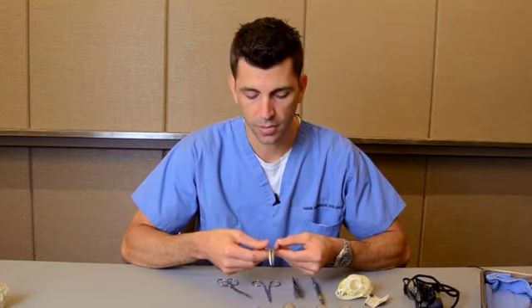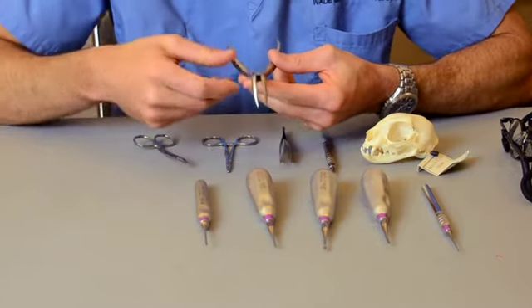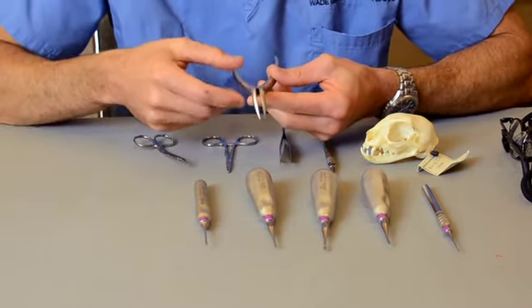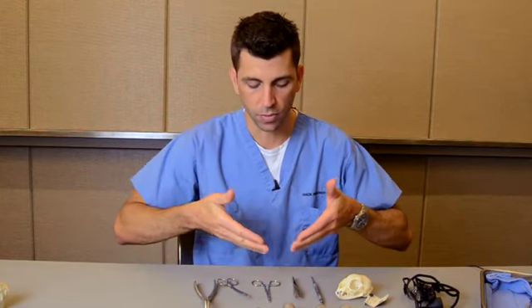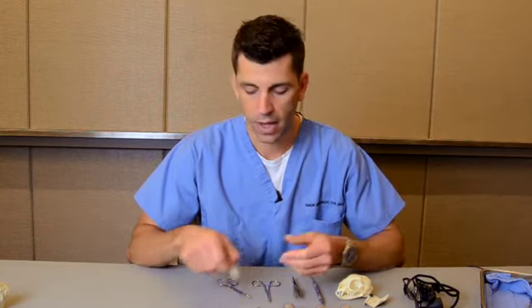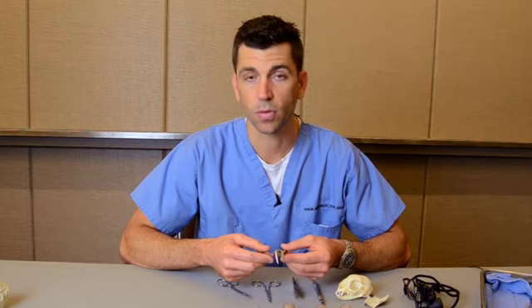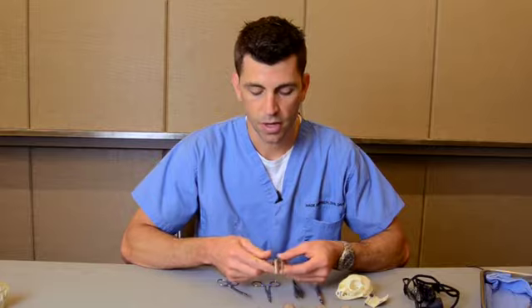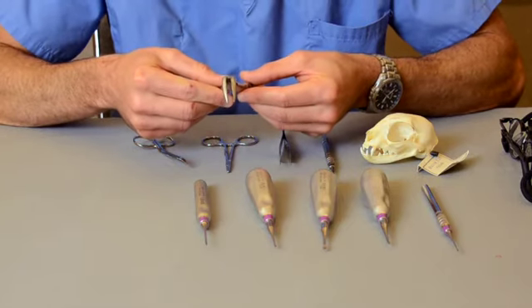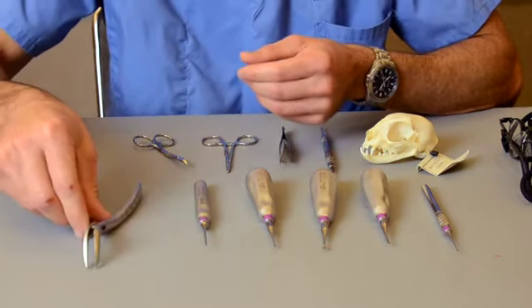This is an extraction forceps that actually has a parallel beak. So it grasps the crown of the tooth with both of the ends in a parallel fashion. A typical or standard type of extraction forceps comes together at an angle with beaks that only touch at the tips. The problem with that is it puts the pressure at one spot on the tooth, on the crown, and it's going to lead to more crown fractures as you apply force during the extraction process. So a nice pair of parallel beak extraction forceps is going to help prevent extraction complications such as fracturing the crowns.